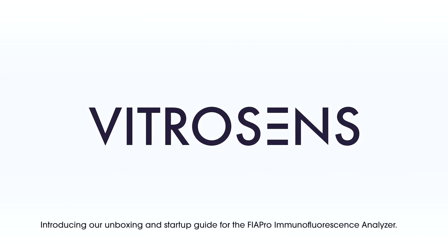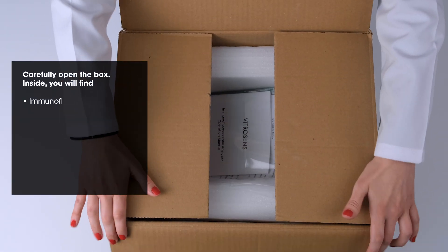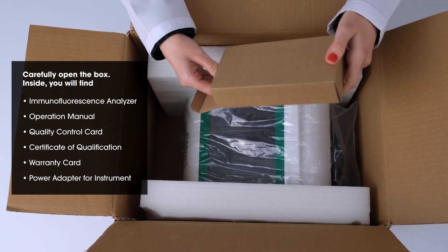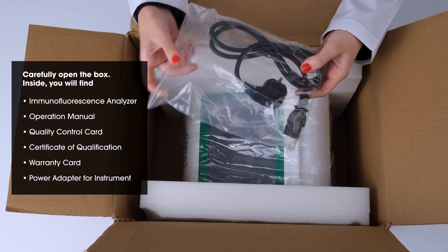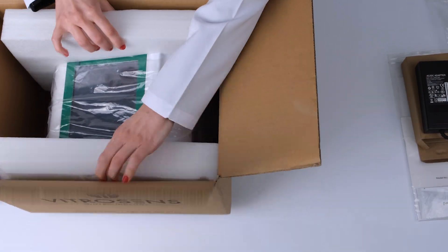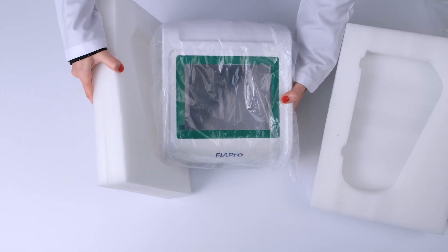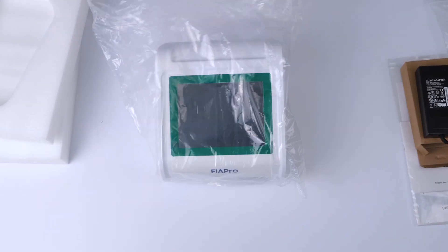Introducing our Unboxing and Startup Guide for the FIA Pro Immunofluorescence Analyzer. Carefully open the box. Inside, you will find: Immunofluorescence Analyzer Operation Manual, Quality Control Card, Certificate of Qualification, Warranty Card, Power Adapter for Instrument, and Special Pedestals.